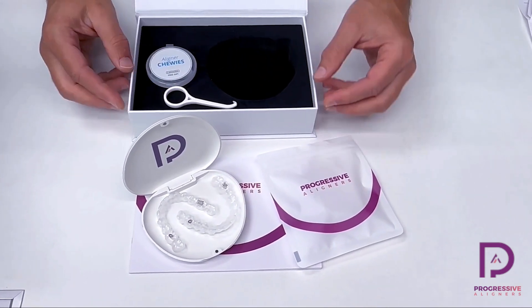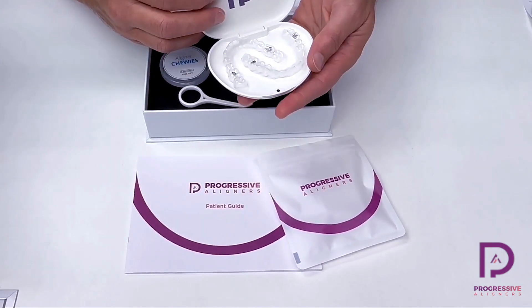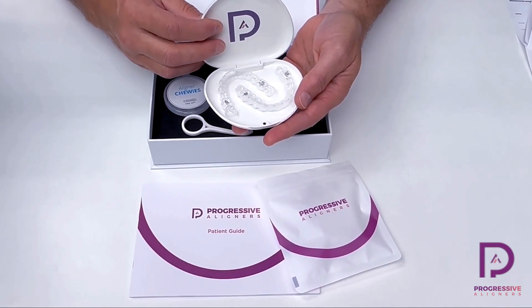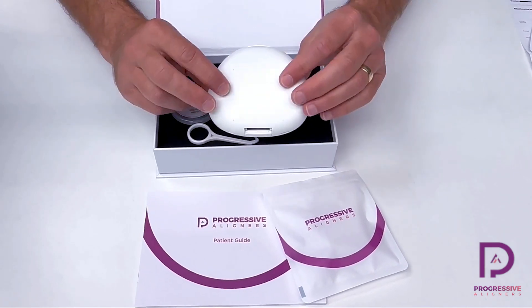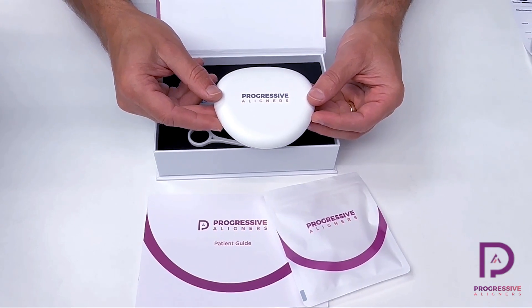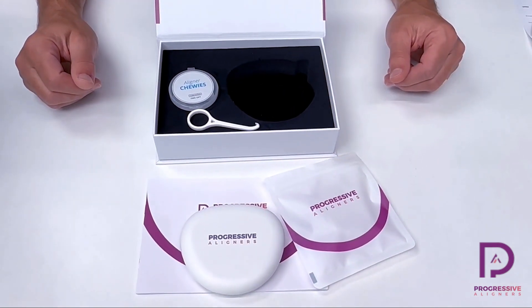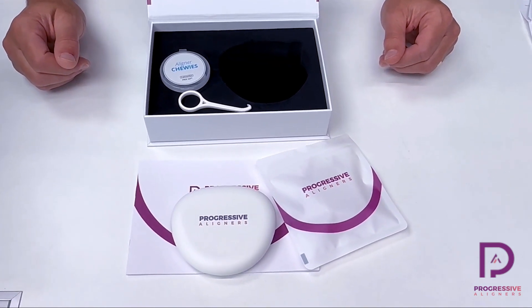That is everything that's inside the patient kit and what they'll be taking home. They'll be walking around most of the time with their one set of aligners that they're actually using and their aligner case, where they'll hold their aligners whenever they're out of their mouth. We're excited for you to use this product — we know your patients are going to love it. Thanks for joining us.